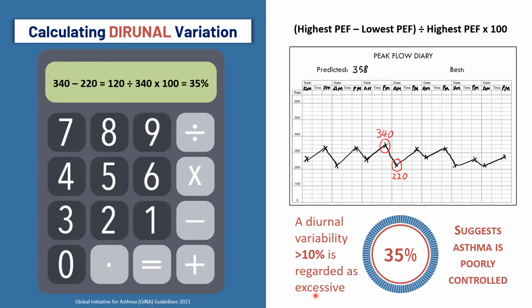We'd never ever in a million years do that, because we know that that test is nowhere near as accurate as an HbA1c. The other thing we know is that that test just tells us about what's happening at that moment in time. It doesn't give us a bigger picture. So for me, in asthma, a one-off peak flow is a bit like a BM stick, whereas a diary over a few weeks is more like an HbA1c.